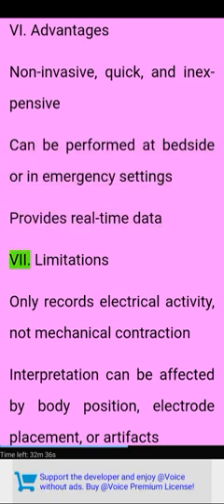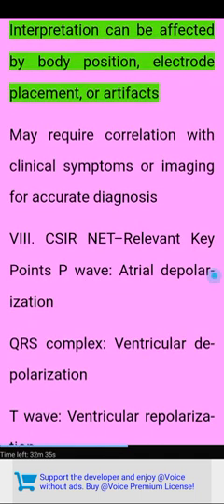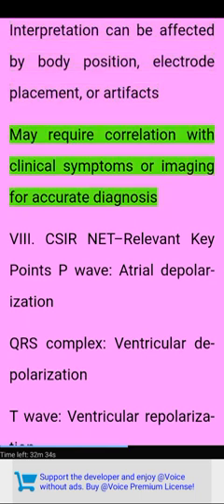Provides real-time data. 7. Limitations. Only records electrical activity, not mechanical contraction. Interpretation can be affected by body position, electrode placement, or artifacts. May require correlation with clinical symptoms or imaging for accurate diagnosis.